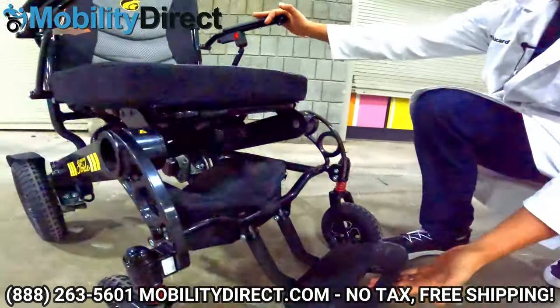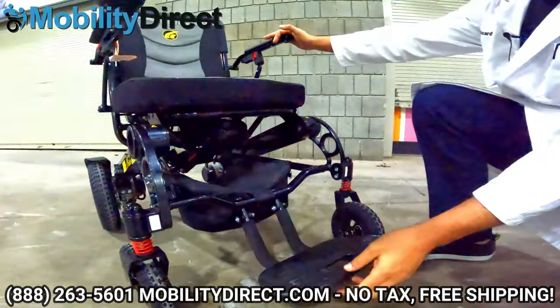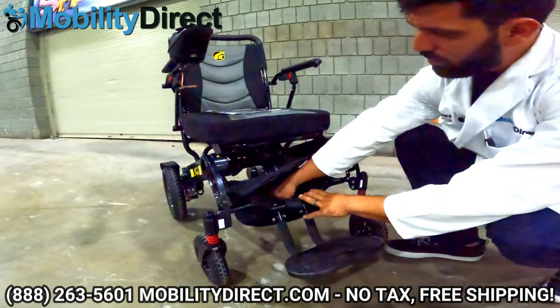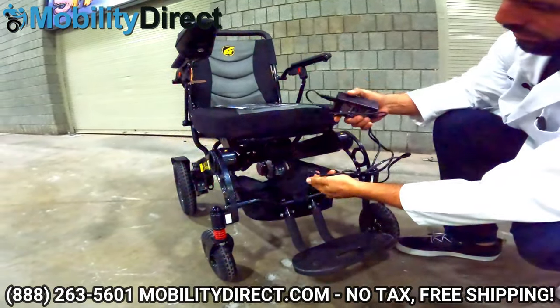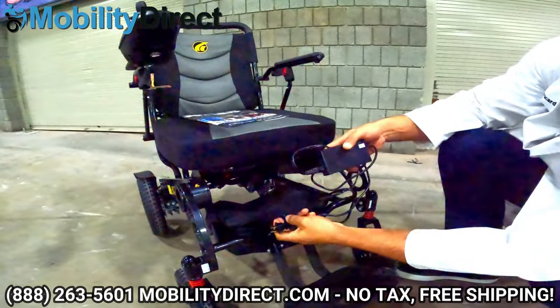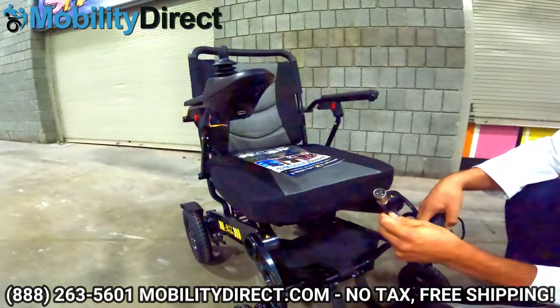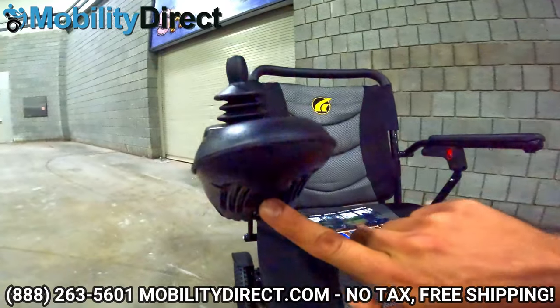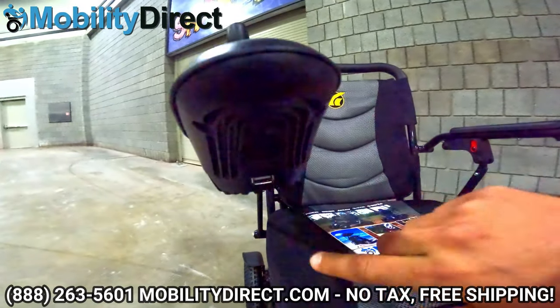Moving to the front, we have a flip-up footplate and a storage basket, which you can use to keep your charger. The charger is very straightforward with a light indicator that turns green when the battery is fully charged. You just plug one end into the wall, and the other end is a barrel connector with three pins that plugs right in.